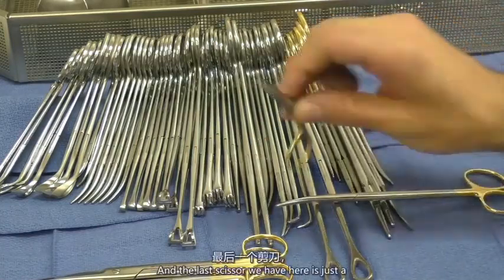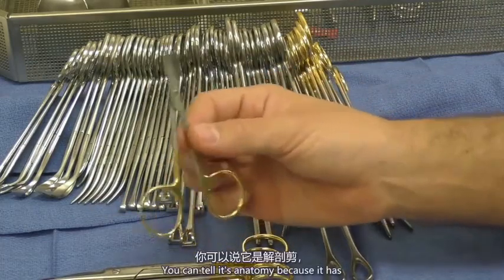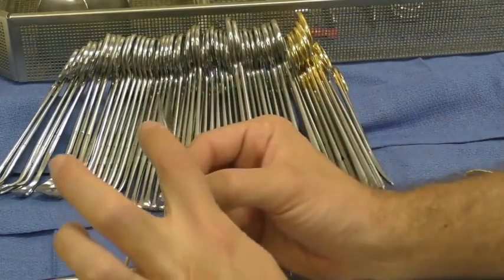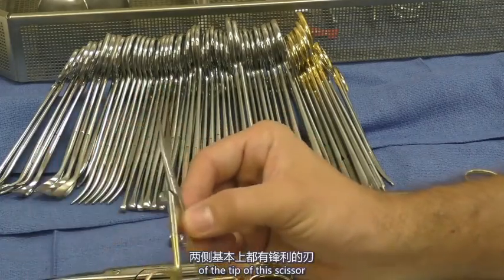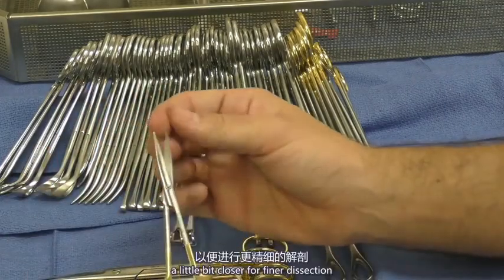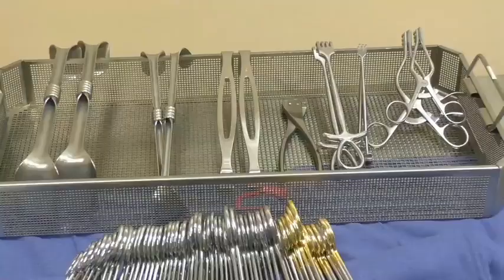And the last scissor we have here is just a small little Stevens tenotomy scissor. You can tell it's a tenotomy because it has basically like little cutout on either side of the tip of this scissor, just to bring it up a little bit closer for finer dissection and more precise dissection.